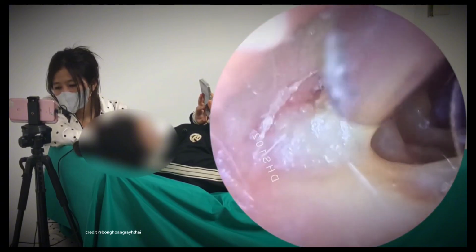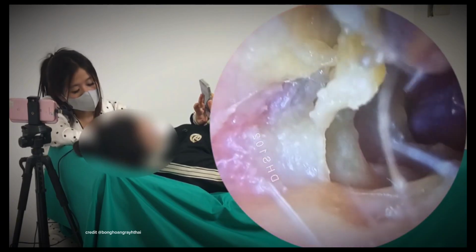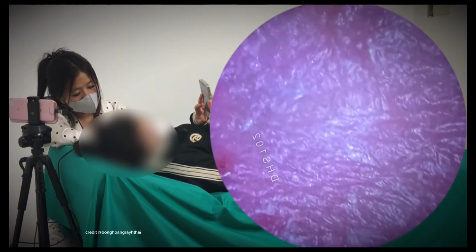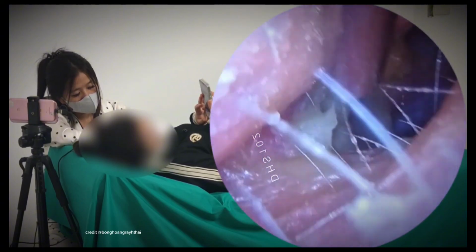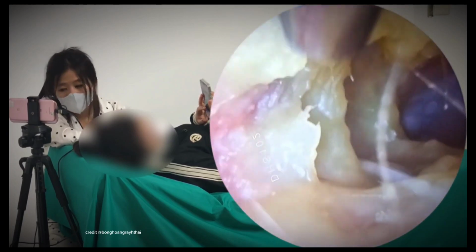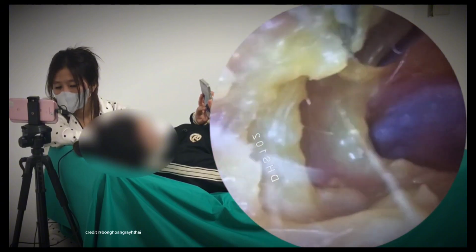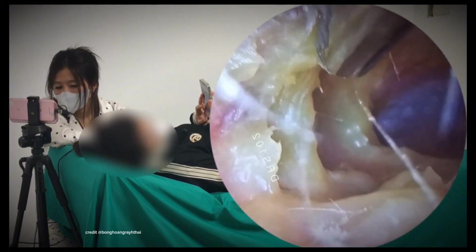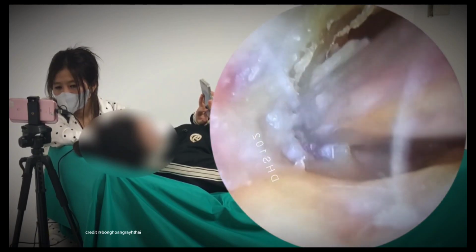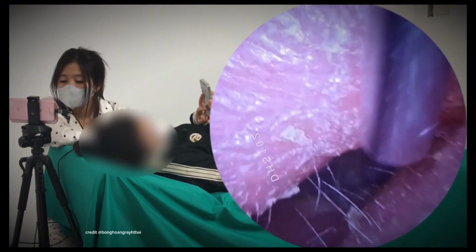Whereas in other parts of the world, if you say surfer's ear to a doctor or a healthcare professional, they'll think that you mean bacterial infection. So those terms are used quite interchangeably. It's much easier just to say otitis externa, which is an infection, usually a bacterial infection, can be fungal, or just say exostosis, which is bony. But here you can see the ear canal's looking pretty clean already.